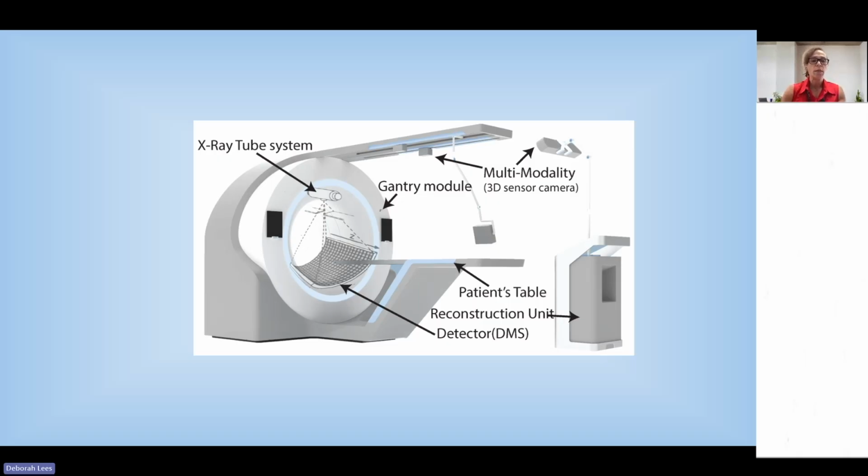Then you've got your gantry, which is where all your bits are underneath, so your detection array is underneath there. Your X-ray tubing is there as well. And then often up here, this is your modality. So often this is where we have our image acquisition, but there's often cameras here. There's various other sets that we use for things like delivering dye, sometimes music, and there's a lot of customization that happens with a lot of these machines. So it's very high tech these days compared to what we used to have 20 years ago.